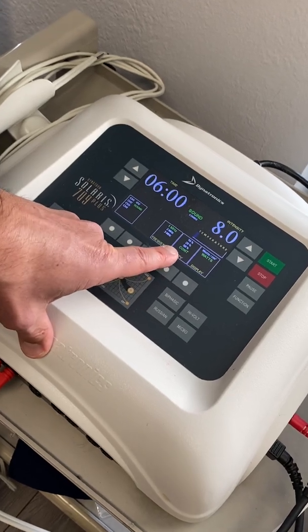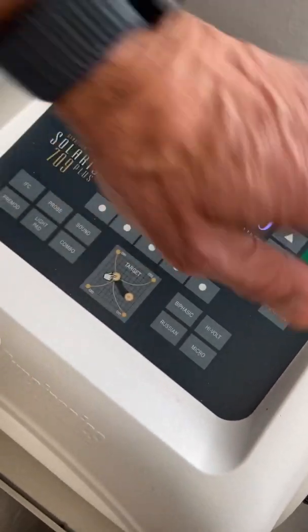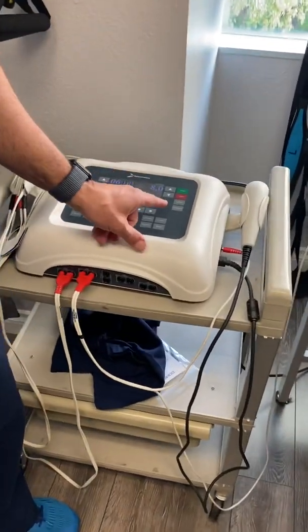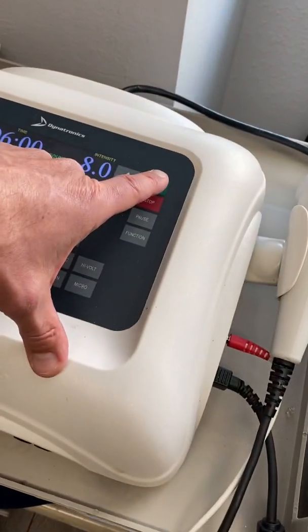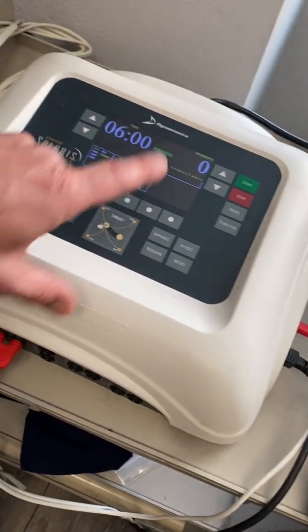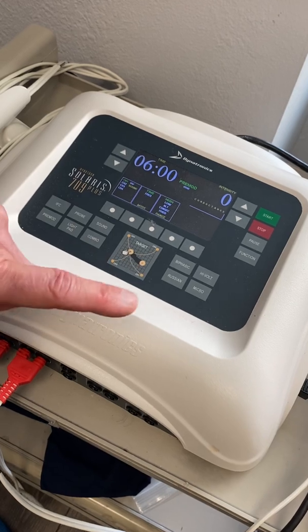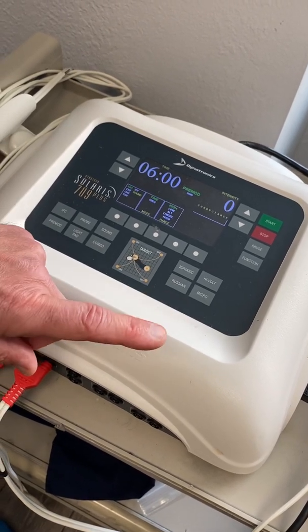It's on continuous, so it's going to generate heat, okay? So that's set up right now. Then what we do is this. You hit start, even though it's not going to start yet. Now we're ready for the electrostim side, which we're going to go over next. But we're going to do a little quick pause while I grab some ultrasound gel, okay?